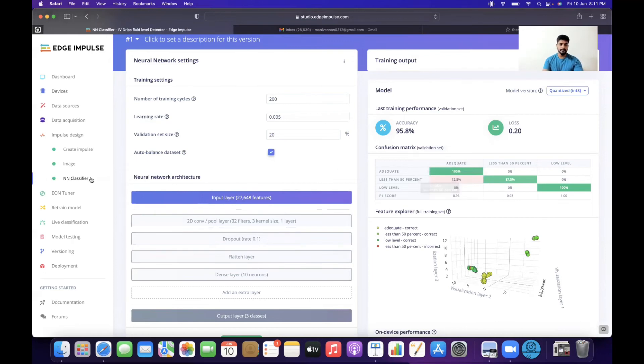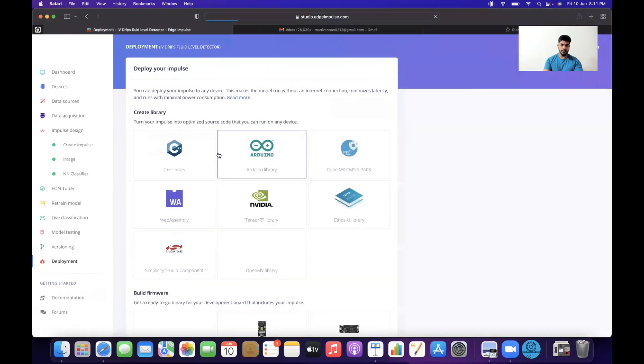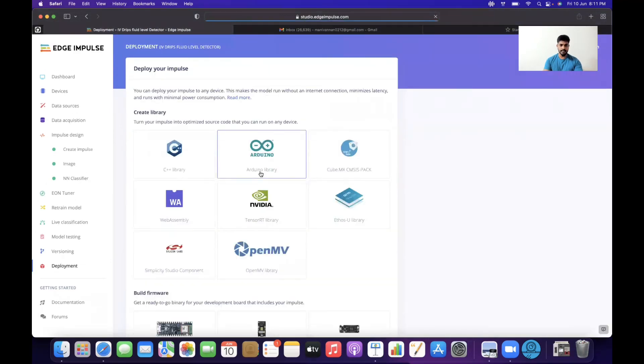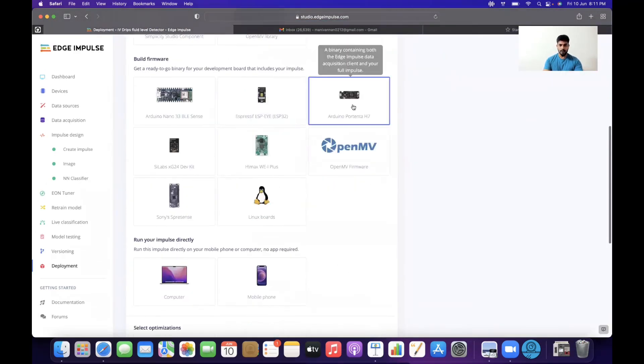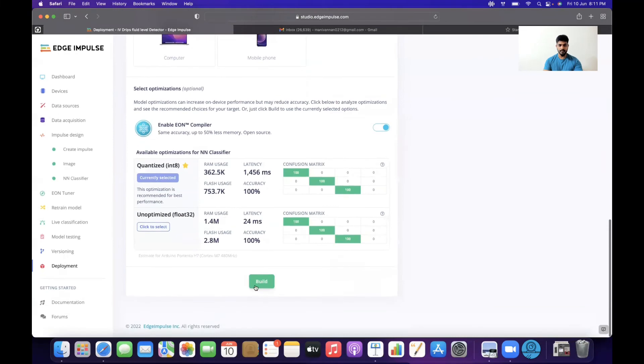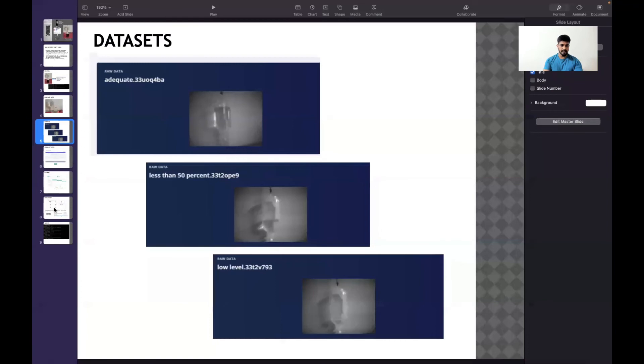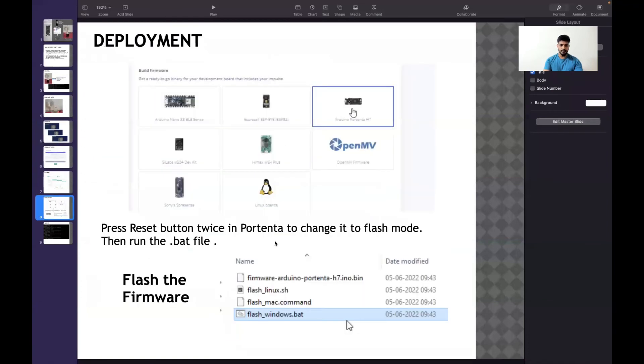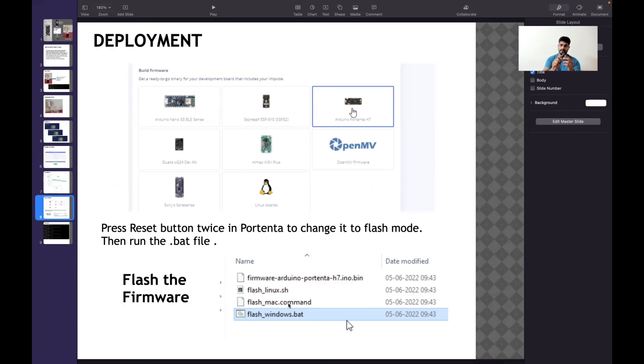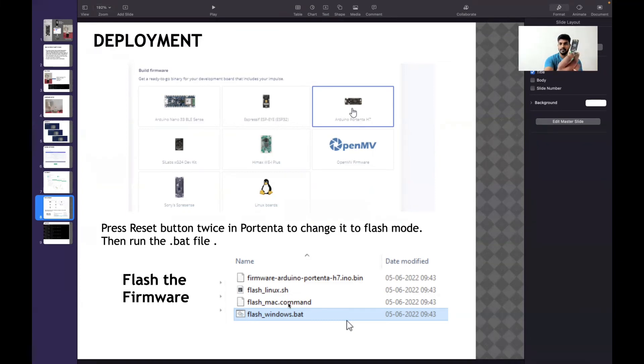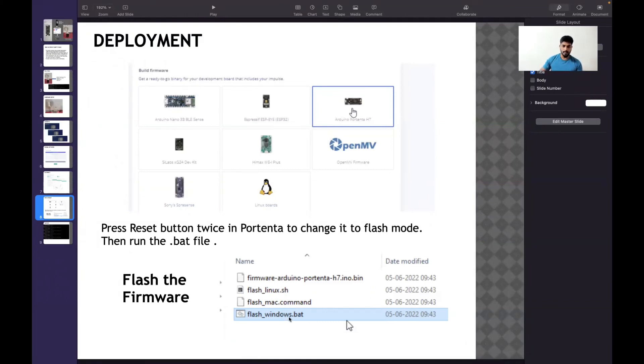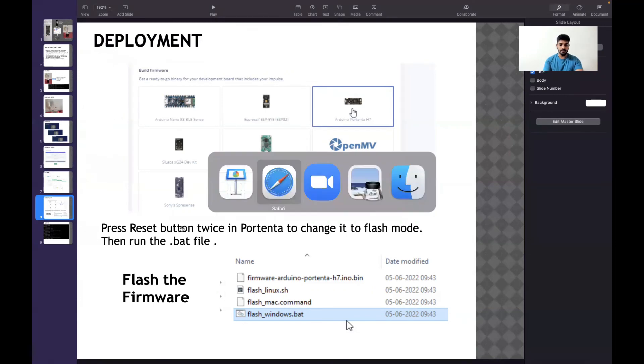I built the software. Once built, it downloads as .bat, .command, and .linux files - you can select based on your OS. Make sure you press the reset button twice on the Arduino Portenta. You can see the LED green light fading in and out, indicating it's in flash mode. Then click the .bat or .command file based on your OS. Once done, type 'edge-impulse-run-impulse' in the command window.